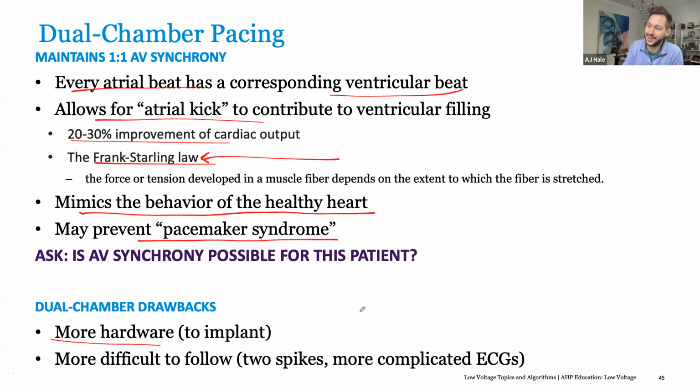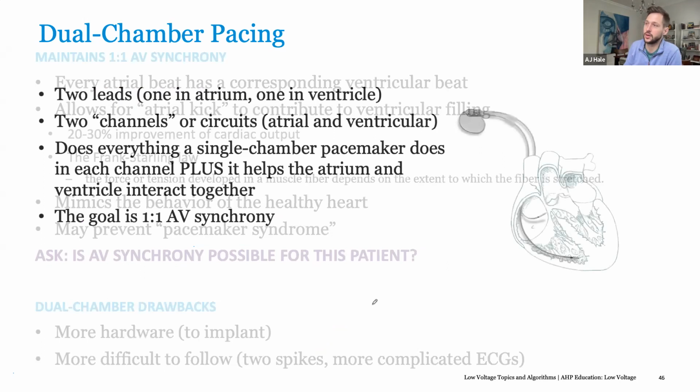And then obviously dual chamber modes, we're talking DDI, DDD. It is more complicated. So for the people who are going to support this in the field, it's something to keep in mind. It's not necessarily going to be the easiest thing to regulate.